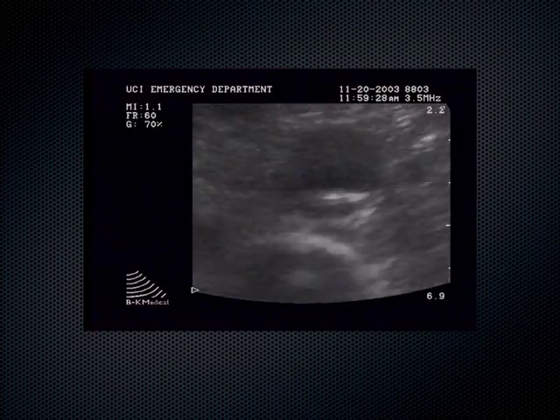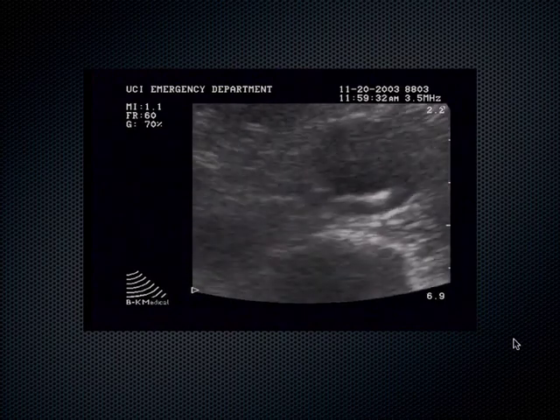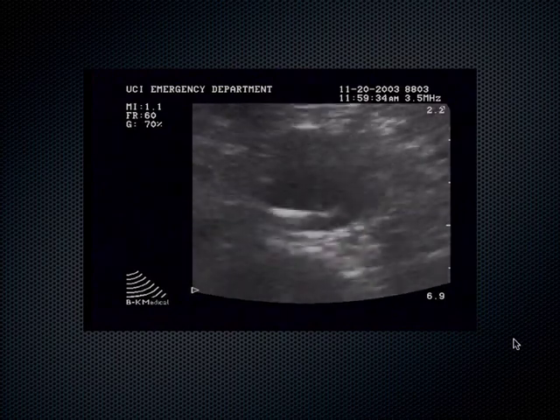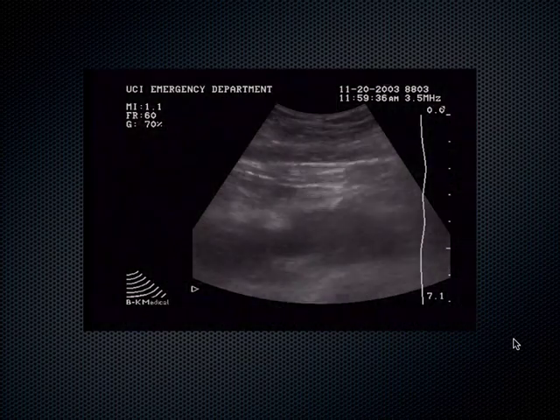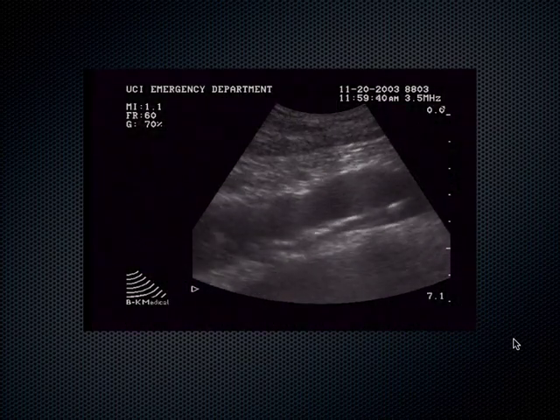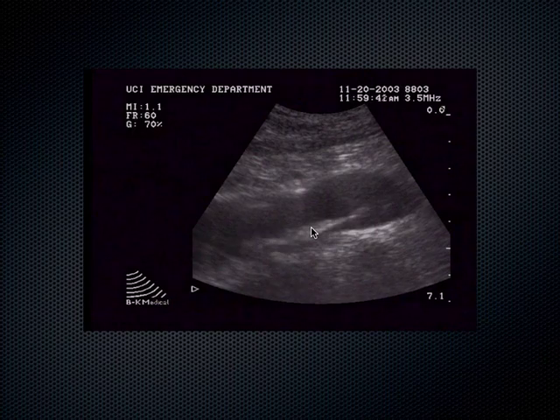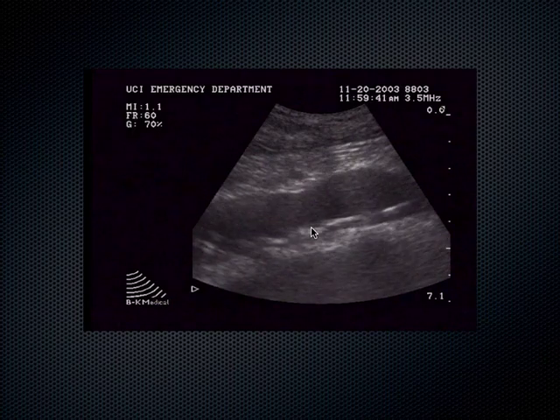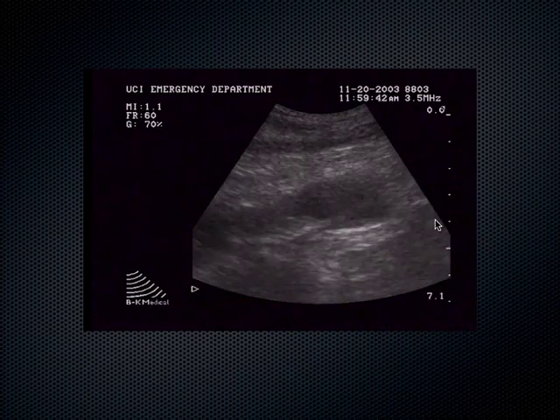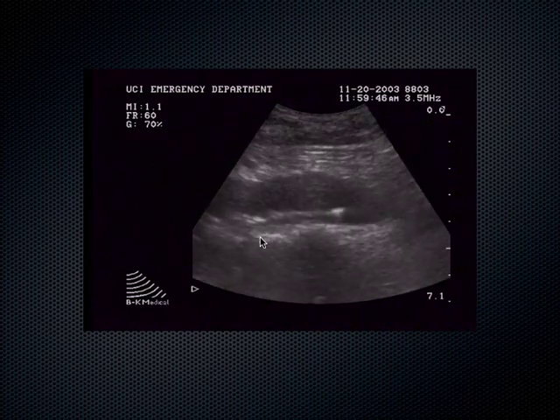What's this diagnosis? Here's the spine shadow right here. We've got it zoomed. Our depth is pretty decreased. What do you think's going on here? We're in the sagittal plane now. Pay close attention to this line right here. Why is it fluttering? How would you describe this? Looks like a valve. It looks like a big valve. Now, arterial structures don't have valves. Only veins do. So what the heck is this?